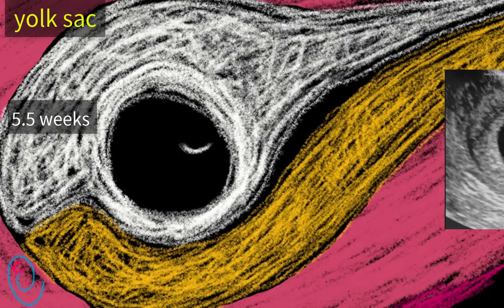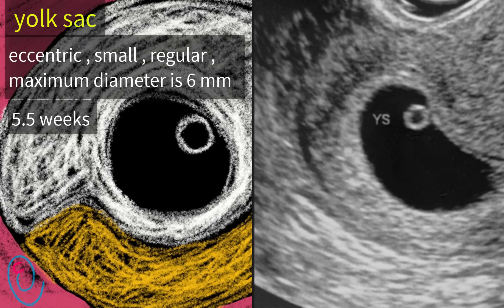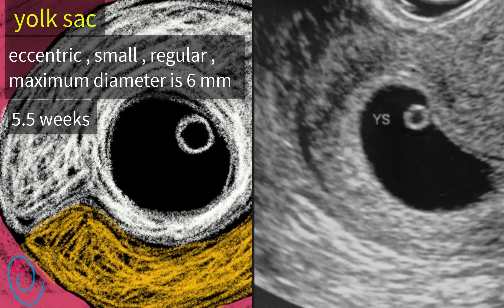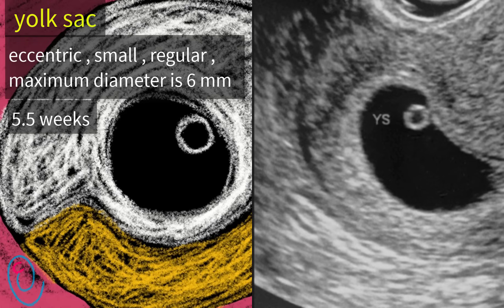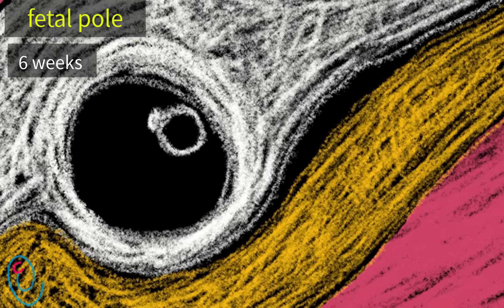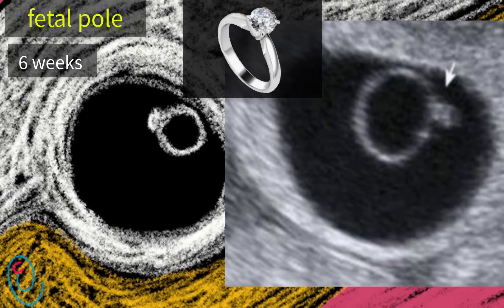At about 5.5 weeks, a yolk sac will appear inside the gestational sac, eccentric in location. It looks like a small rounded cyst surrounded by an echogenic outer layer. The maximum diameter of the yolk sac is 6 mm. The function of the yolk sac is to provide nutrition to the developing embryo until the placenta develops and takes over this function. At about 6 weeks gestation, the fetal pole will be visualized on the wall of the yolk sac. The yolk sac and attached fetal pole together look like a diamond ring, which is why it is known as the diamond ring sign.